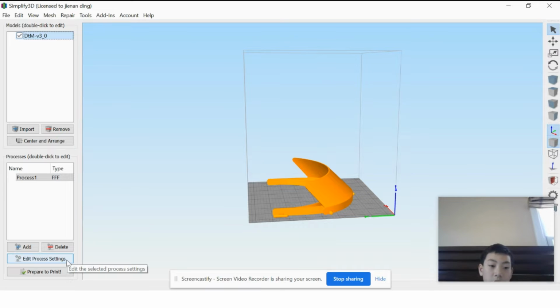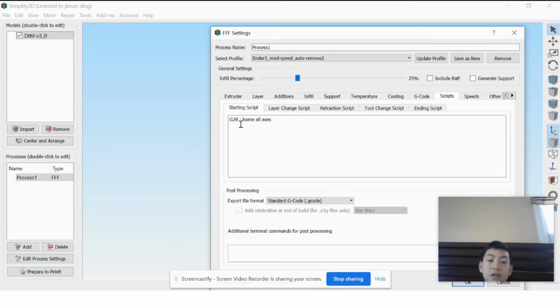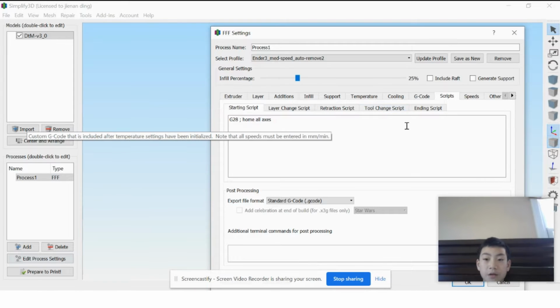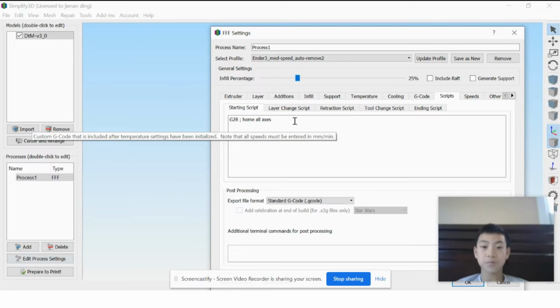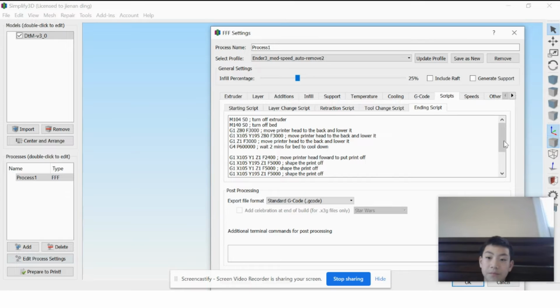Next, you will go into process settings, and you will keep looking all the way, not G-code, into scripts. So, first, the starting script, the layer script, the retraction script and the tool change script are not useless, they're useful, but not right now, because we're not doing anything to the regular print, we're just changing the ending of how it pushes it off. So we will go to ending script.